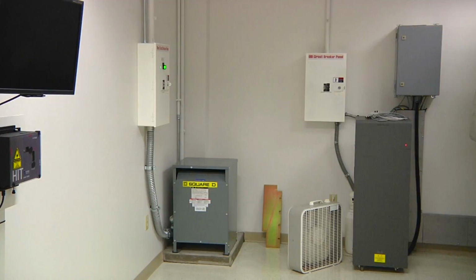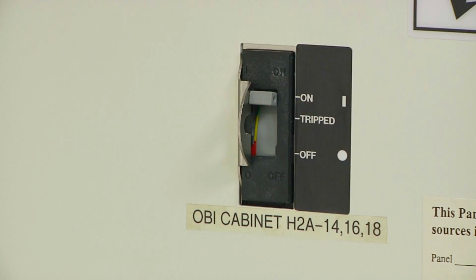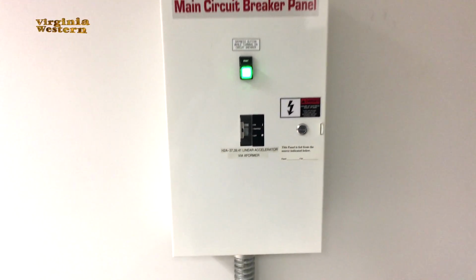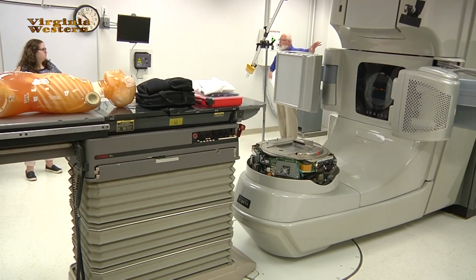Let's power up the system. So you're going to have these two white panels. These are newer to Varian, and these are the main circuit breaker panels. You got one for the OBI, which is for these arms, and then you got one main panel for the rest of the machines. Usually these are in the console area, so you'll find those out by the treatment machine or by the door, someplace like that.